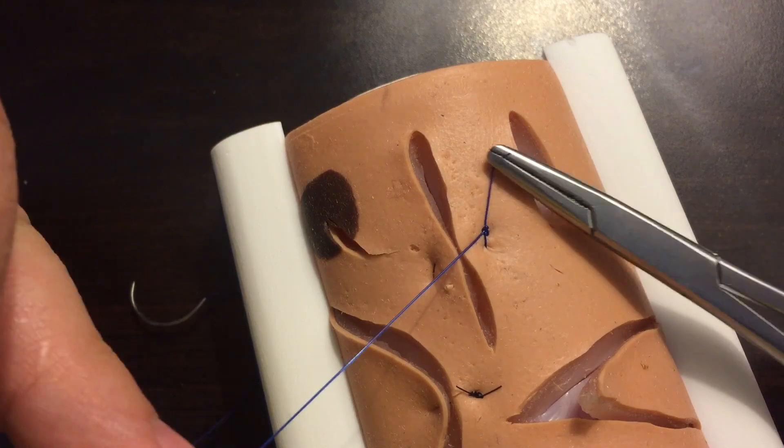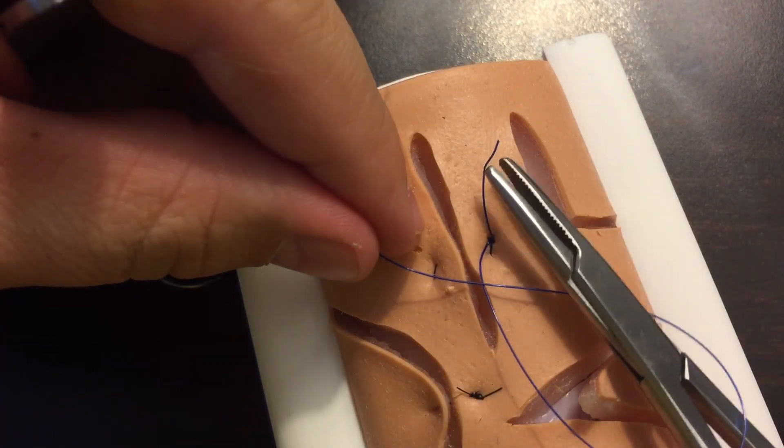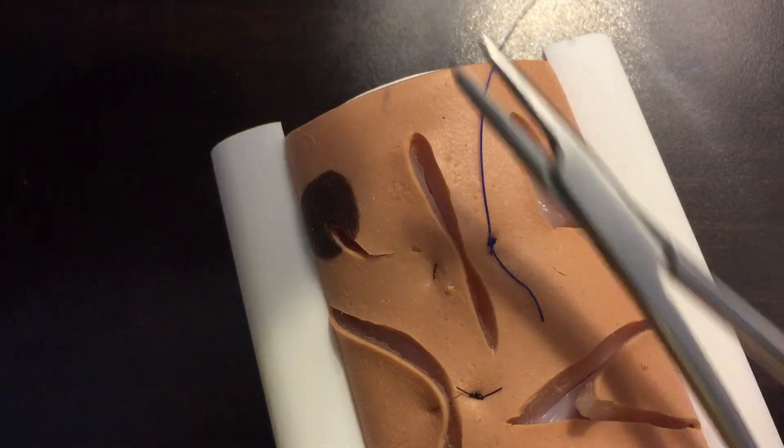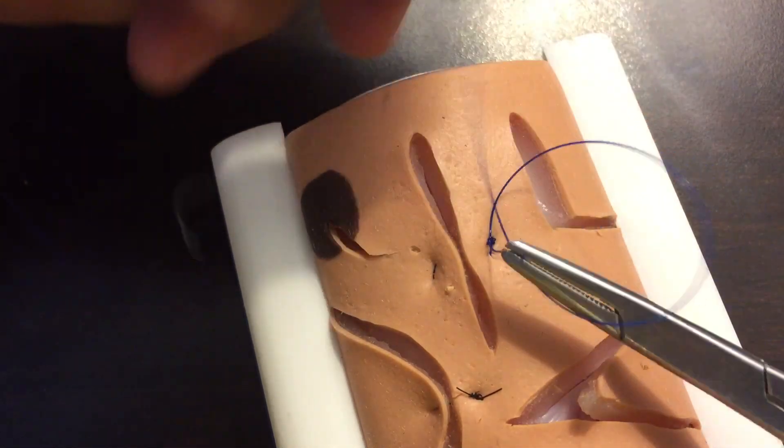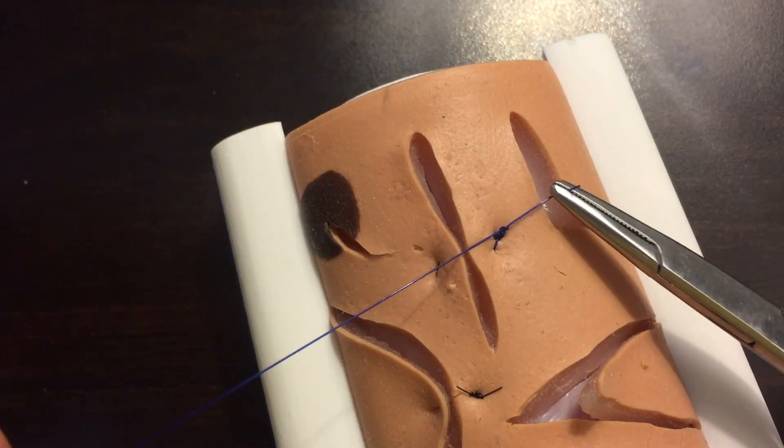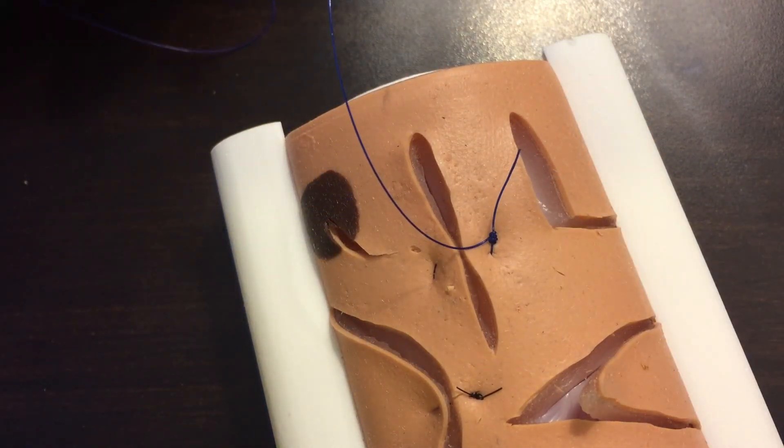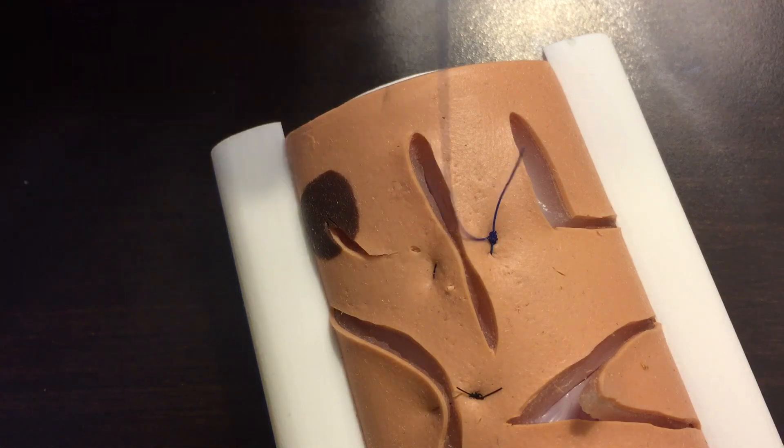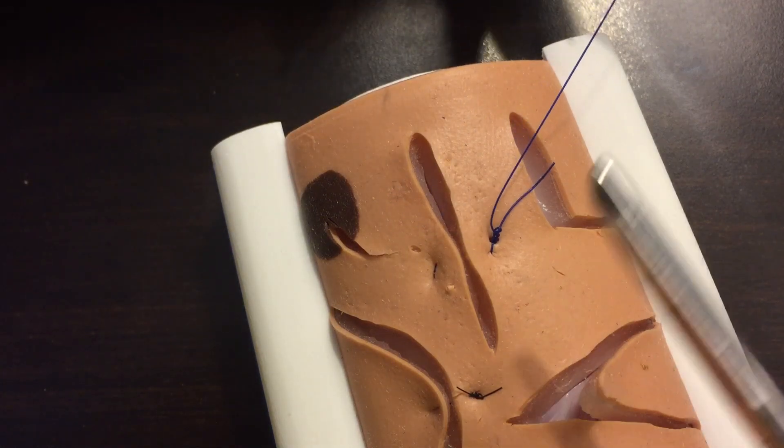The vertical mattress and the horizontal mattress can be used for a lot of the same types of situations where you've got a little bit of tension and you need to have a stronger suture to pull the edges together.